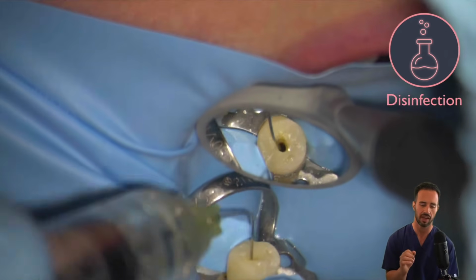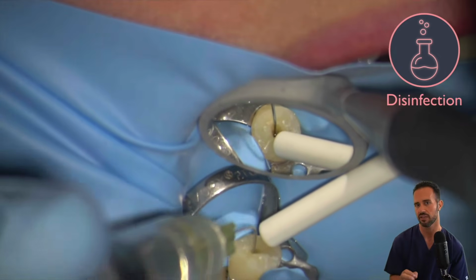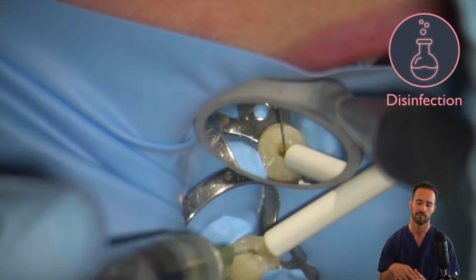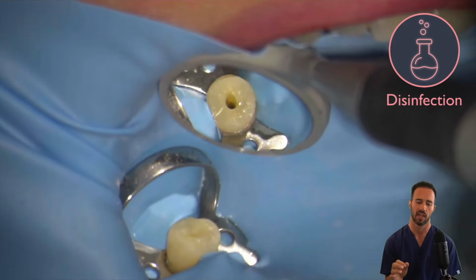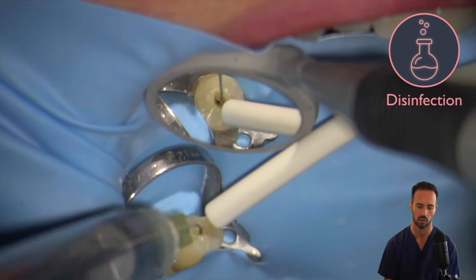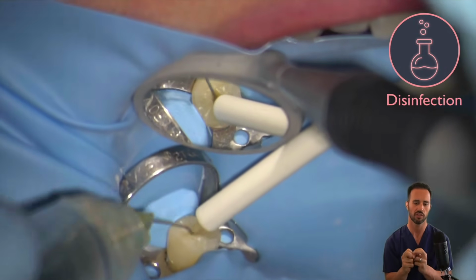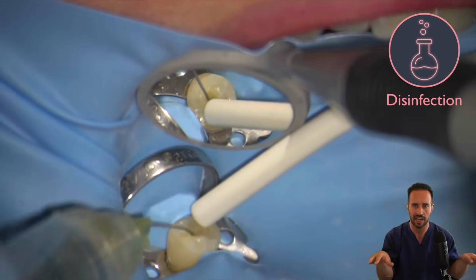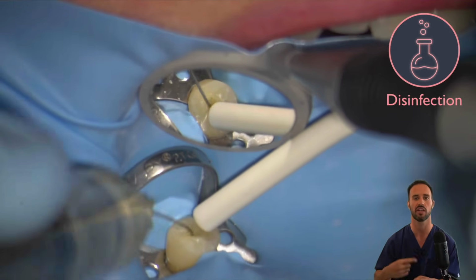So now we're aspirating out after we've done our initial bout of sodium hypochlorite, and we're introducing our 17% EDTA rinse. You don't need a whole lot of this, but you want to stick it in there, pass that through, let it soak for a little bit, and then you're going to aspirate out and go back with our final rinse with the half-strength sodium hypochlorite. The EDTA is going to remove the smear layer within the tooth. And then the last flush with sodium hypochlorite is going to allow that cleaning action a little deeper into the tubules that have now become open from the administration of the EDTA.